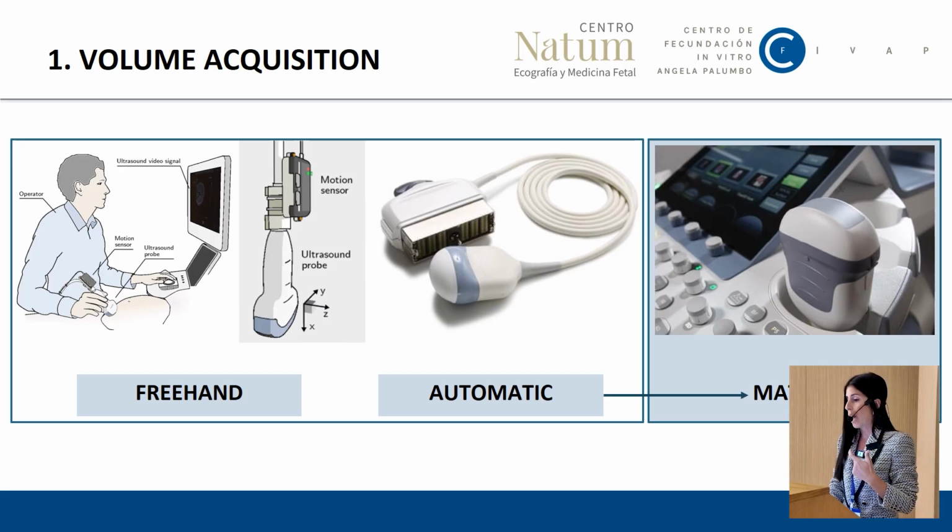And as part of the automatic systems, there is a newer technology known as the matrix probe that contains a large number of crystals and is electronically driven. It allows scanning in two planes simultaneously and permits actual real-time visualization with a very rapid sweep.